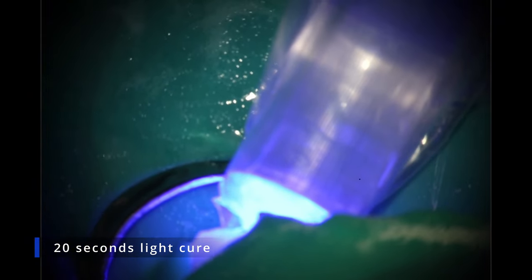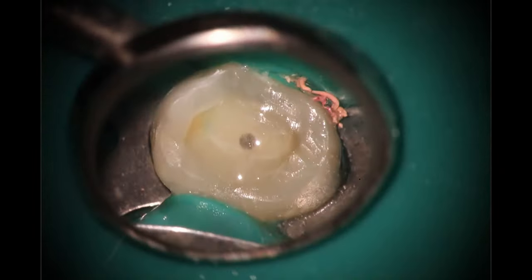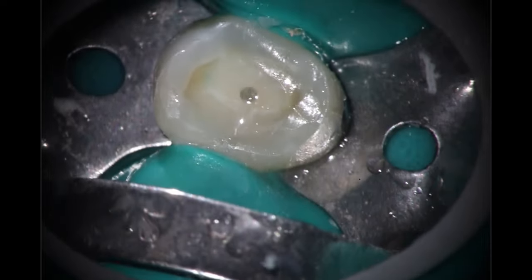I like to come back in with the Centrix tube after using the post because there's usually a little divot or void created by that. Backfill one more time and compact it down with the Glick to make sure everything is nice and I don't have to do as much cleanup at the end. Then a 20-second light cure. Luxicore is a dual-cure material, so the 20-second light cure on top hardens the most coronal aspect so I can go in and polish it. Coming in here with the same wheel bur to get it down to where the natural tooth structure is.